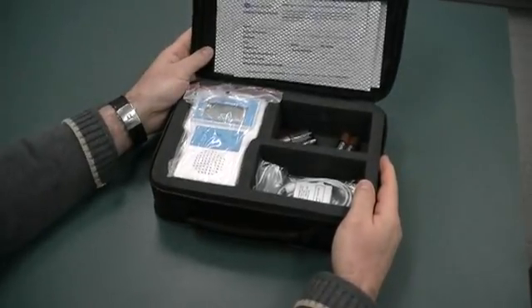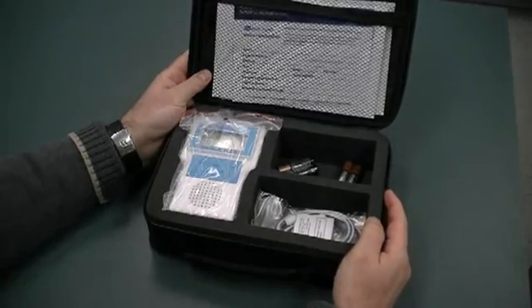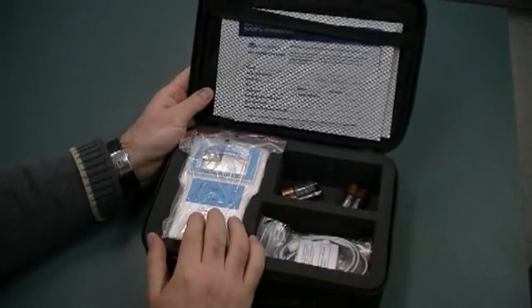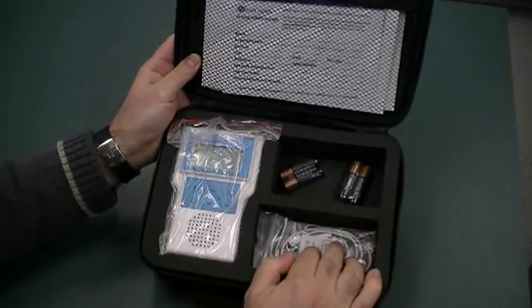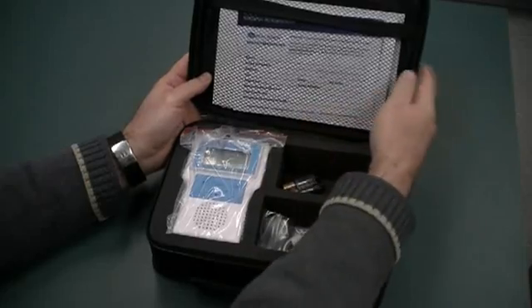Okay, so what we have is a MileGuide unit, some batteries, place for the cables, and there's some literature in here.